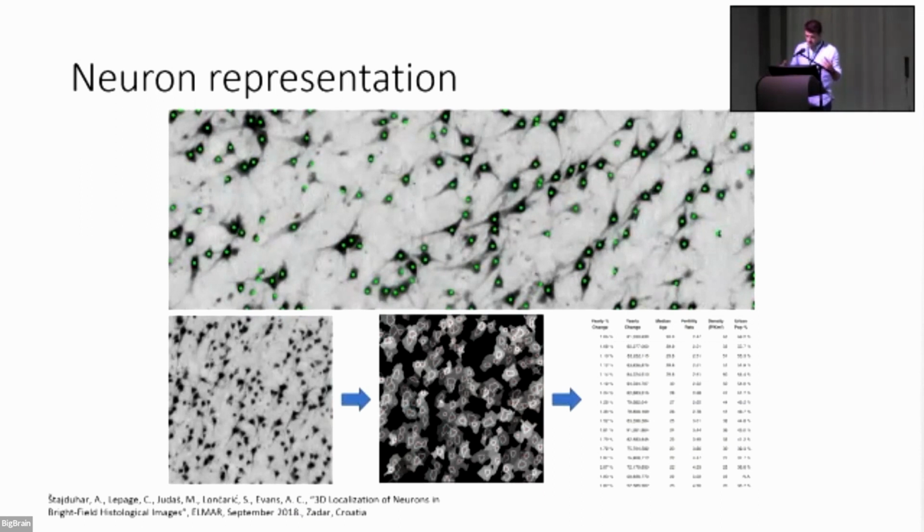You could say this is something like neuron-to-vec, if you're familiar with embeddings and representations. When you have this vector representation, it's no longer unstructured data, but structured data of all the neurons in the slice, and then you can apply various machine learning and data science methods to get your results.